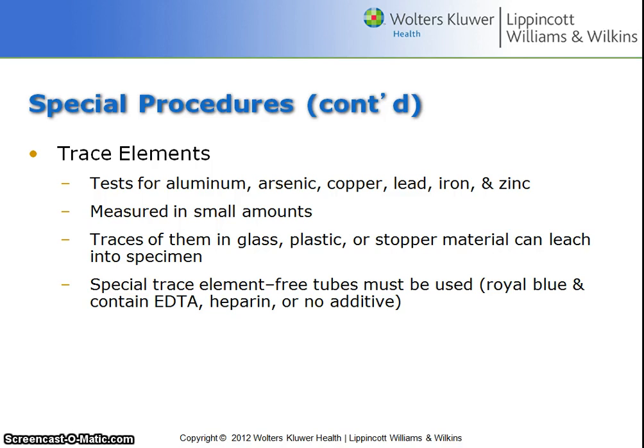Trace elements. Test for these elements you see right there. Special trace element free tubes must be used. These are the royal blue tubes. Of course, you want them to be free of trace elements if you're testing for trace elements.